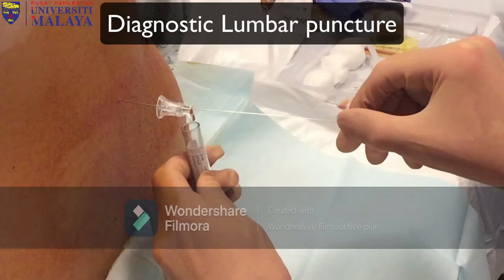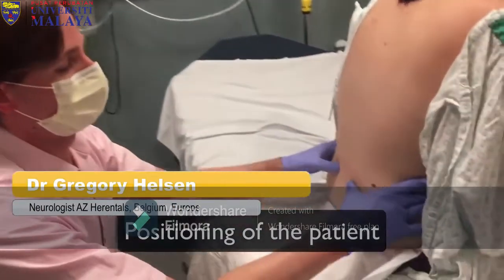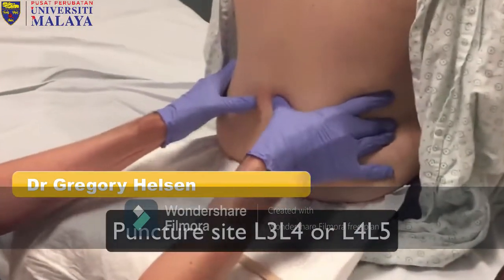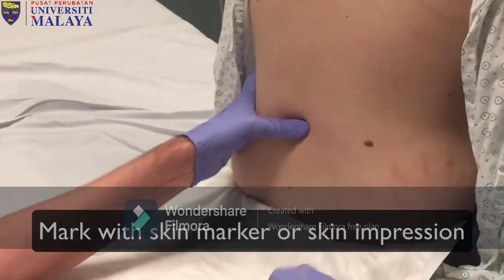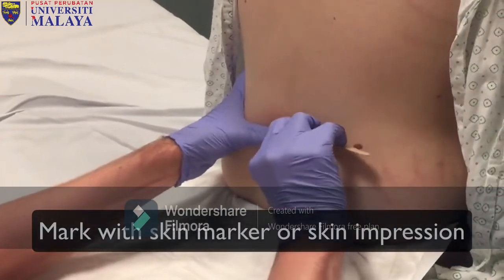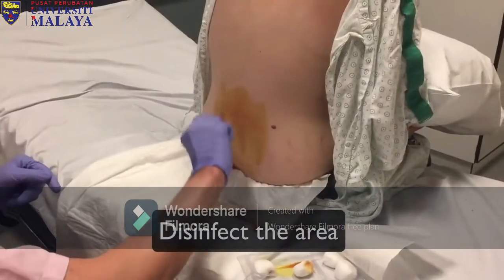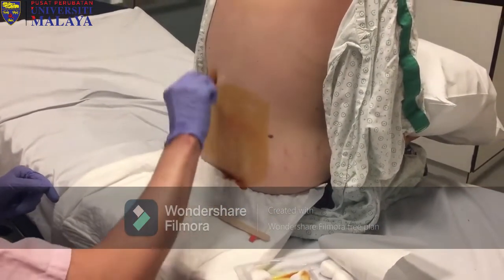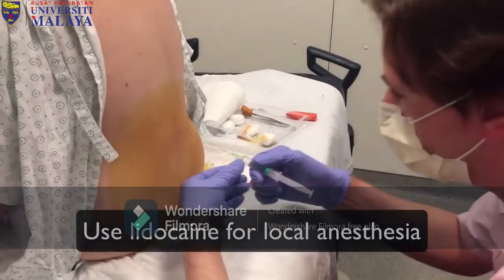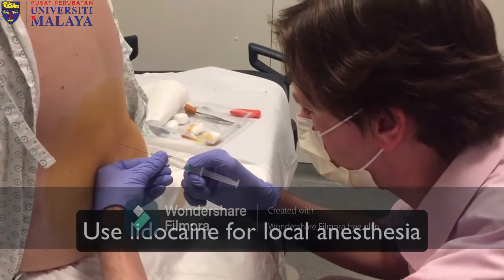Lumbar puncture. The patient should be in a seated position, bending forward, or lying on their side. The puncture site should be at L3, L4 or L4, L5. Draw a mark on the superior iliac crest that indicates the level of L4. Disinfect the area with 2% chlorhexidine plus 70% isopropyl alcohol. Inject 1% lignocaine for local anesthesia at the subcutaneous level and slowly infiltrate deep layers.